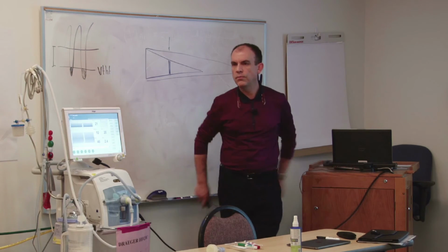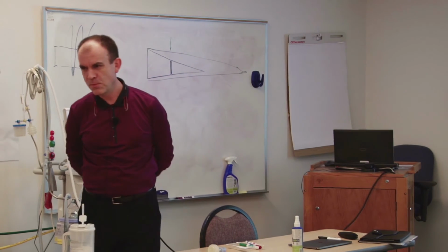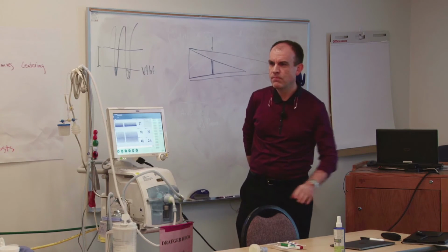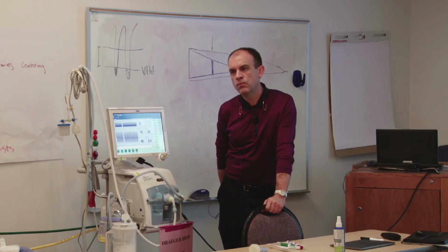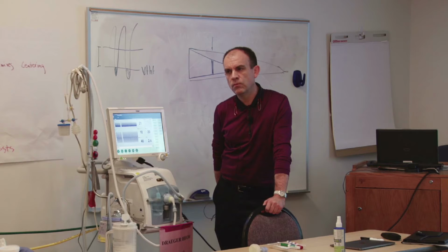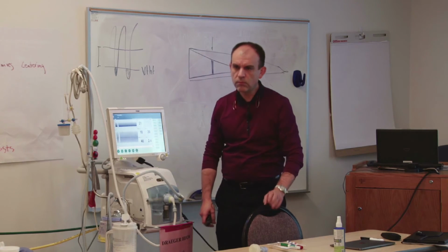So what is in your mindset? I'm just trying to shift because, in conventional, 4 to 6, and as you get closer to 4, okay, we're ready for extubation. So is there a tidal volume or VTHF on here that, if you get down to 1, you're like, okay, now we go to conventional? How are you saying, okay, I'm ready to wean off high frequency with these settings?